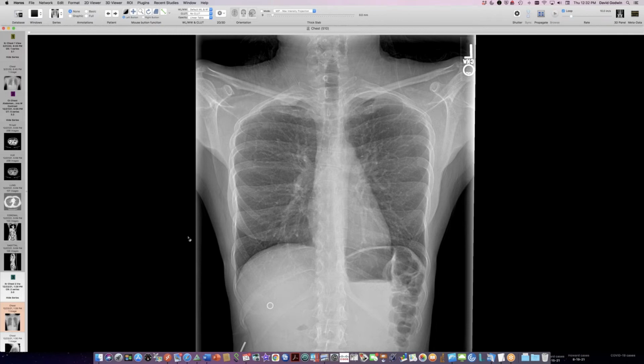Okay. So this is a new entity for me. This person has this chest radiograph from, I think, December, and has some lesions here in the apex. So we have these convexities at both apices. This sort of thing made me think, could this be neurofibromatosis with some neural tumors up there in the apices, given the symmetry on both sides and everything. Other lesions I've seen up here have been things like traumatic meningoceles from motorcycle trauma and tear of a root sleeve and formation of a pseudo meningocele there.